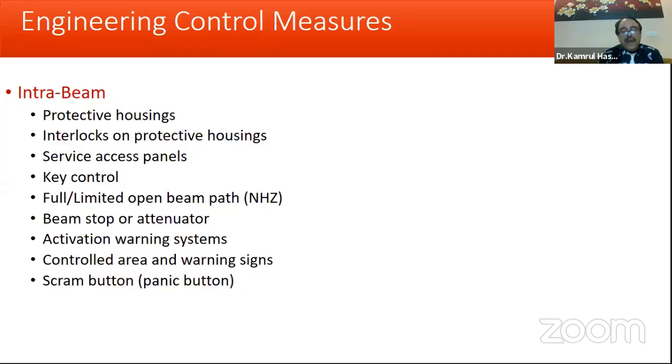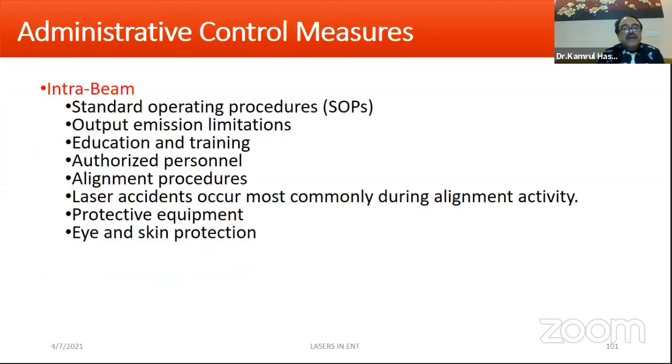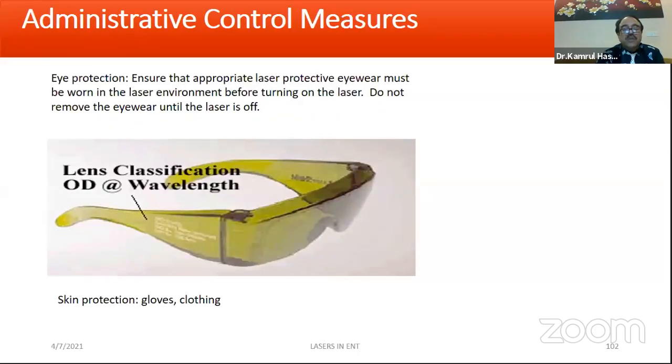Generally, if the proper double cuff anesthetic laser tube is not available in our hand, then what do we do? We wrap the endotracheal tube. Wrapping is sometimes dangerous, because the size of the tube is changed and there is a chance of injury to the vocal cord. So some people do not prefer it.